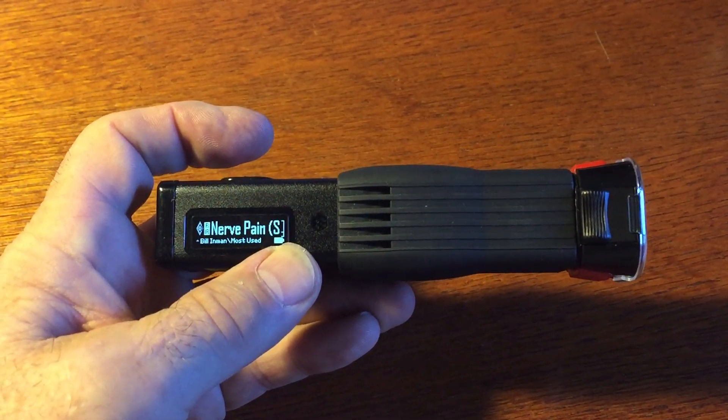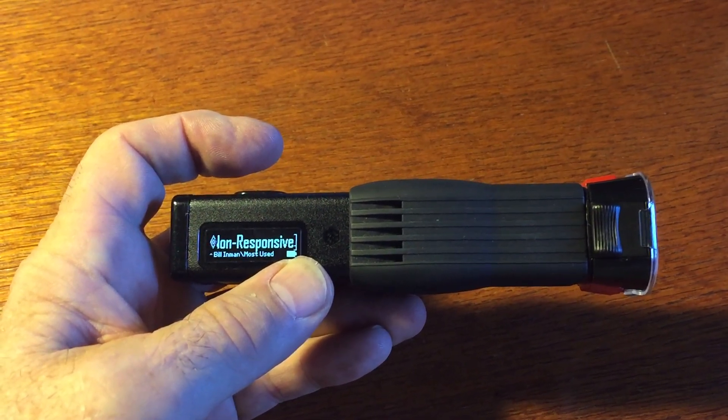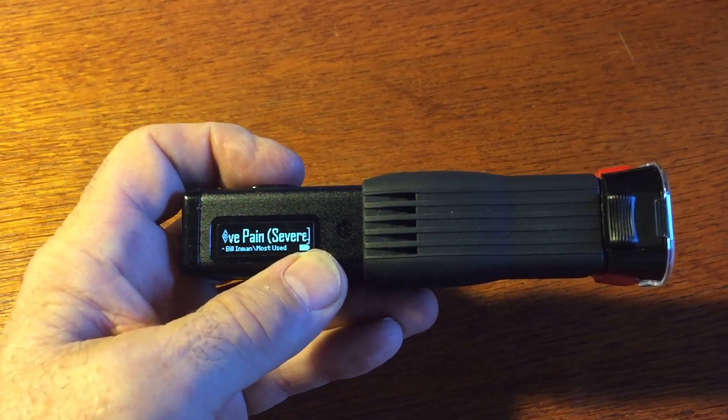No more buttons to push, no more frequencies to program. Essentially it's ready to go. We hit the button, it says put the glasses on, hit the button again, and now it's lasering. Notice that we get a grid pattern instead of a line, which essentially makes it more effective.